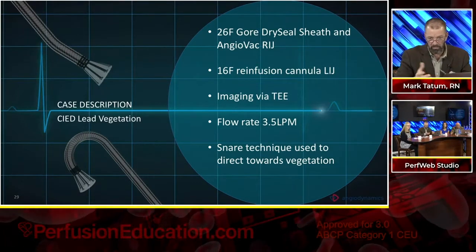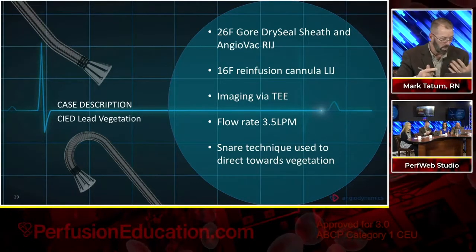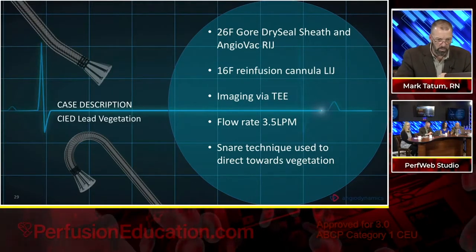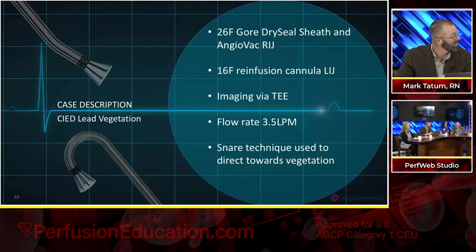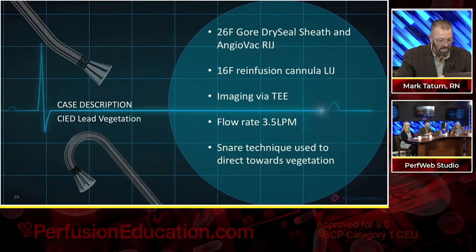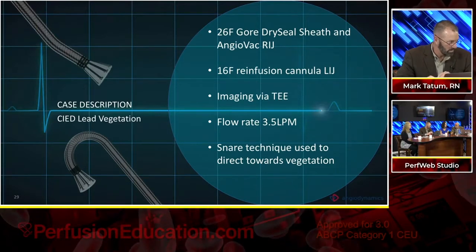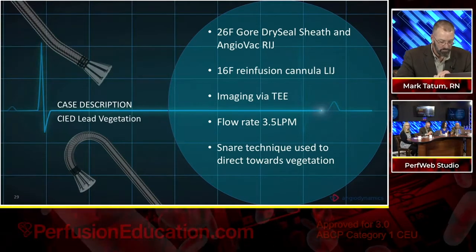As a result, we haven't needed to use those snares in order to direct the distal tip of the cannula like we used to. All right, next slide. I've done that snare with Dr. Matoyer. I tell you what, he did a great job with it. It worked. It's challenging, but he did it and it worked really well.